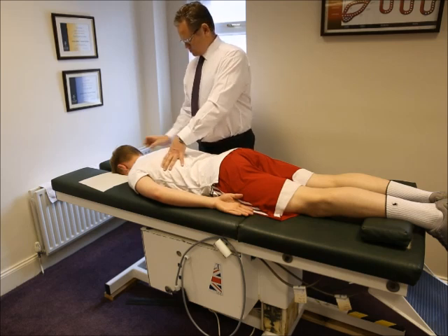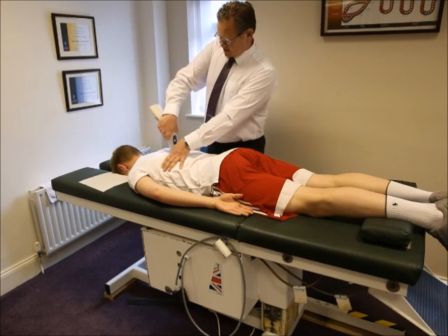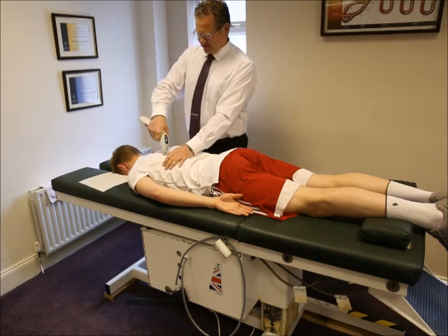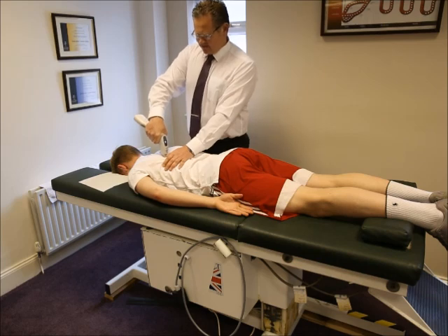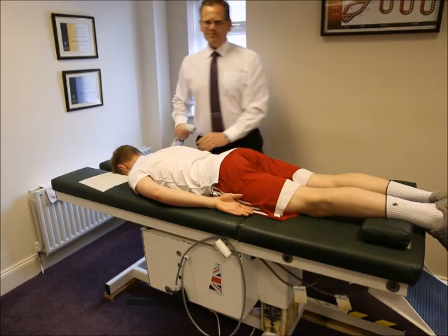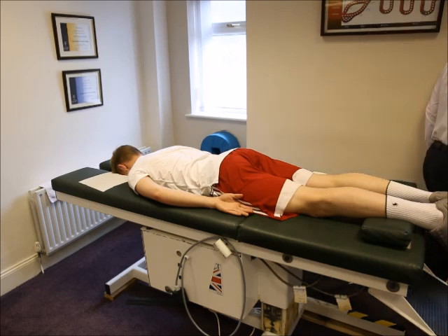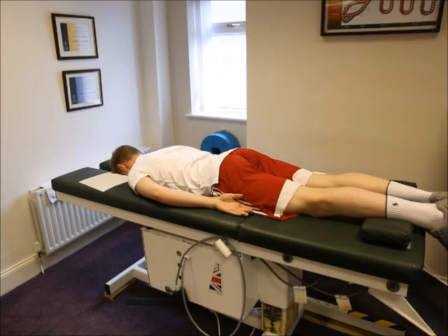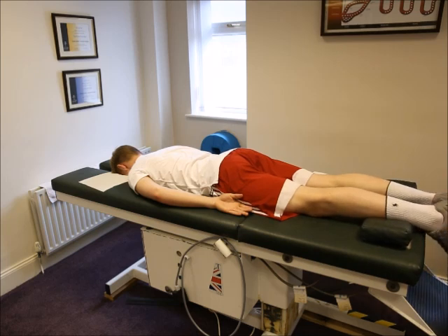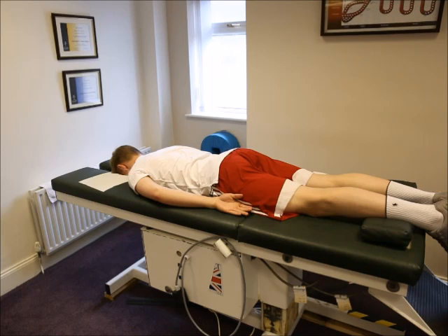This all looks very relaxing — have you ever had any patients fall asleep? They don't lie down long enough — the average treatment session is about 15 minutes, so there's insufficient time. A lot of people do comment on how relaxing it is. There's nothing unpleasant about this technique.